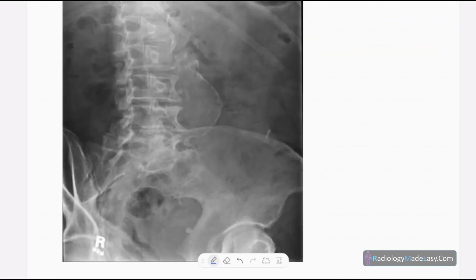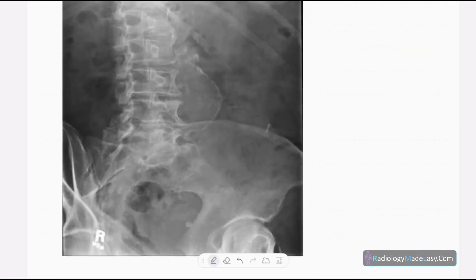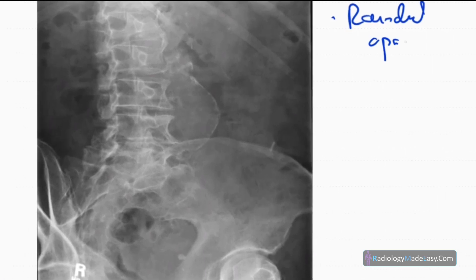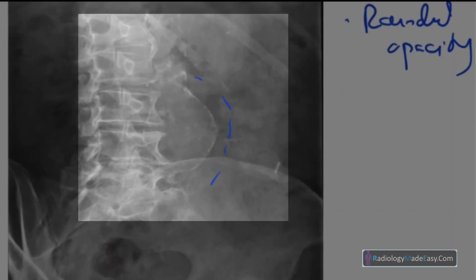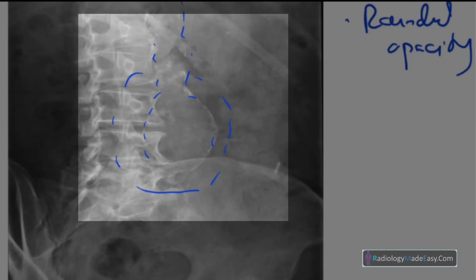This is the anteroposterior radiograph of the abdomen of that patient. There are some positioning abnormalities due to old age, so it is not centered properly. But there are some abnormalities here — you can see a rounded opacity in the midline of the abdomen, positioned in the lower abdomen.